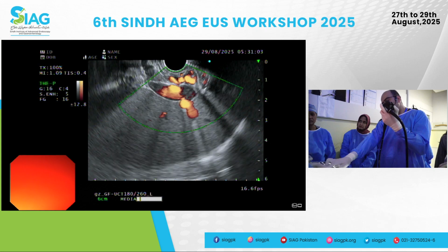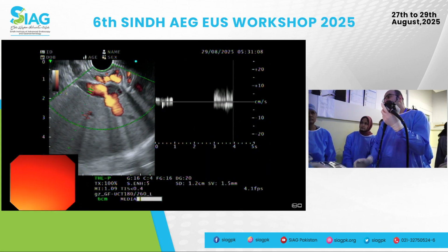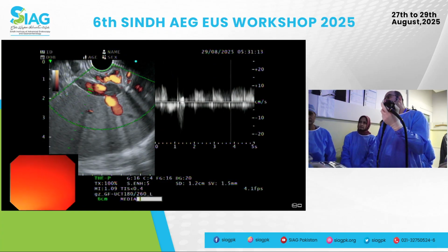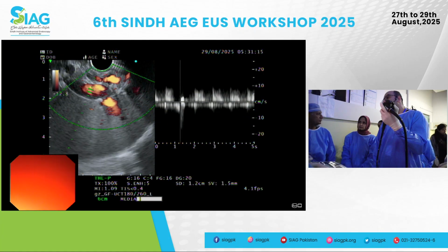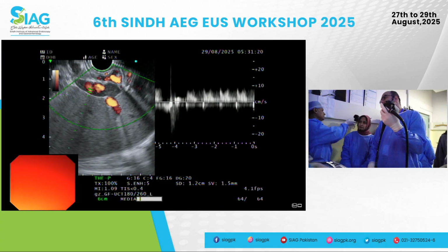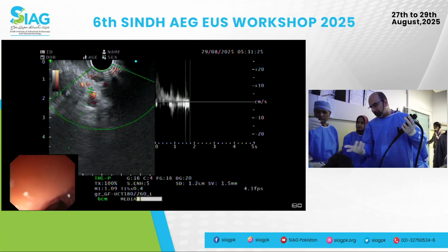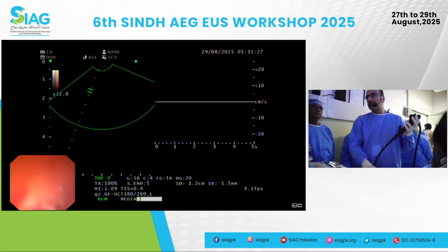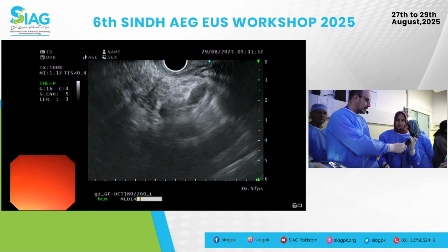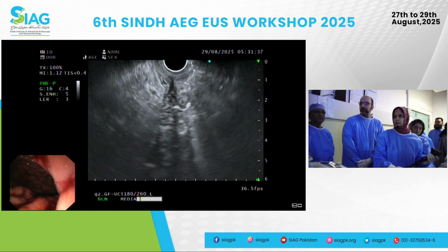It's okay to take your time on these things and study them. There's no rush to complete your exam, because this is why this patient's here. And look at this, this is your classic flat waveform. When the breathing is stable, you can see that's a flat waveform towards the right of the screen, and that's your venous. Exactly. So yes, we expect this patient has splenic vein occlusion, and we are seeing collateral vessels.